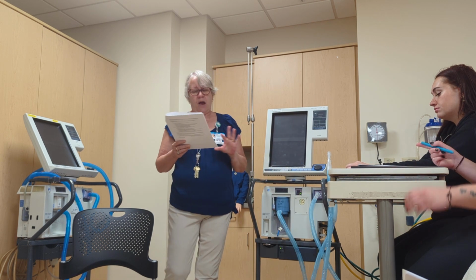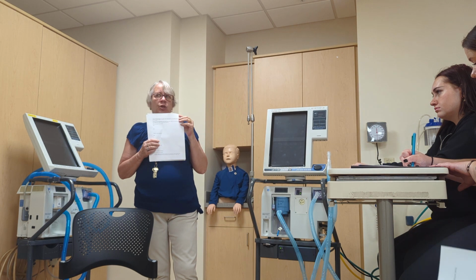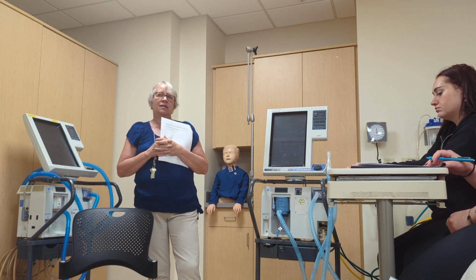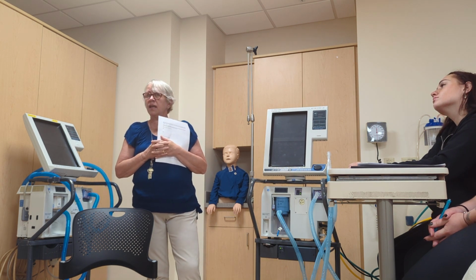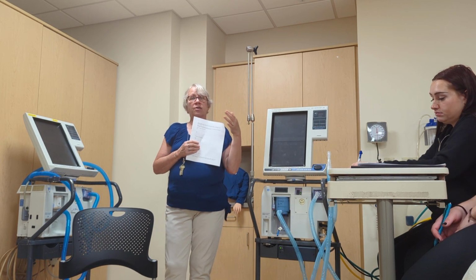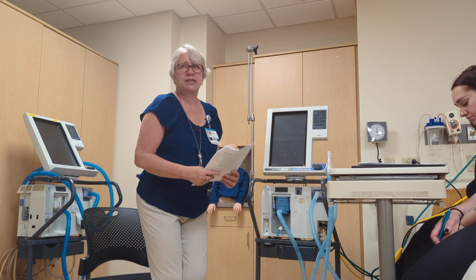All right, our next activity is tubing compliance. Now, you don't have to learn a new calculation. If it says compliance, what calculation do you use? What's compliance? Volume over pressure. C equals V over P. Doesn't matter what compliance you're doing, you just need to know the volume and the pressure that you are using. People get a little confused because it's kind of a two-step process.